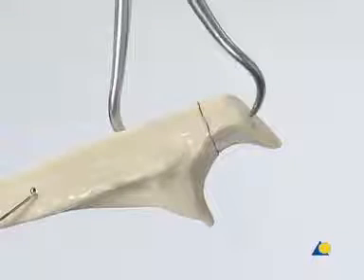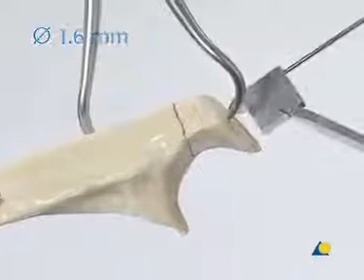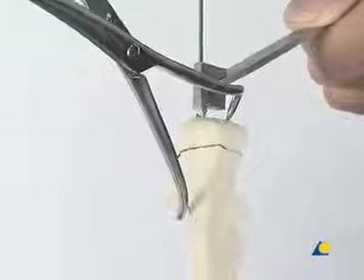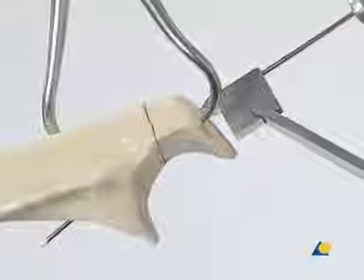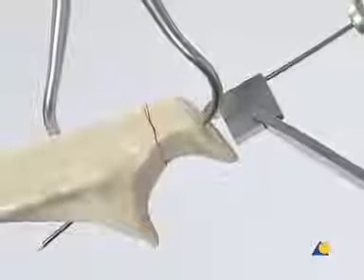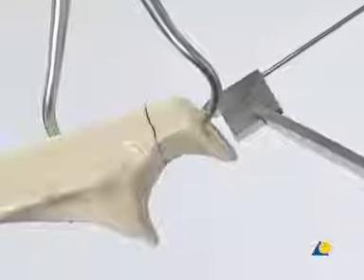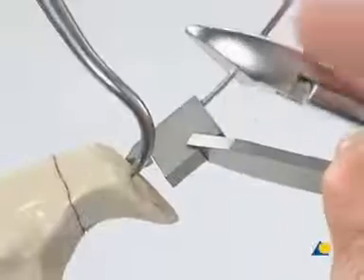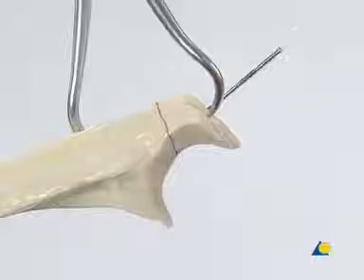Using the triple end of the 2.0 drill guide, the first 1.6-millimeter K-wire is inserted through the point of the olecranon parallel to the shaft of the ulna and as close as possible to the joint. After the anterior cortex has been perforated, the K-wire is retracted approximately 1 centimeter. Using the wire cutters, the K-wire is trimmed obliquely about 1 centimeter above the drill guide. The drill guide is removed.